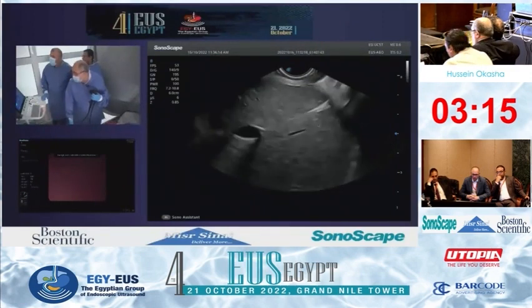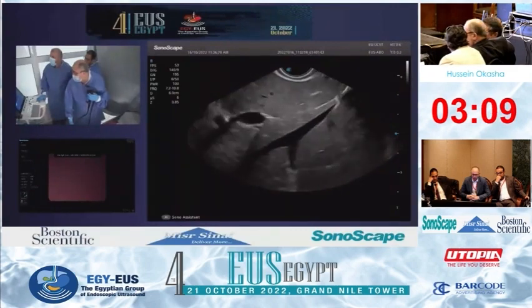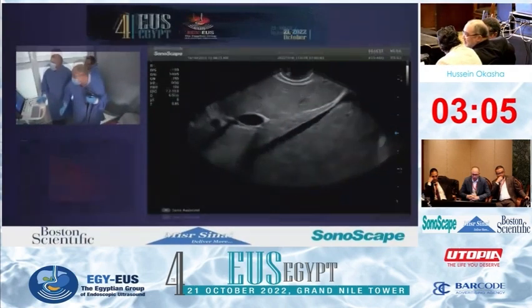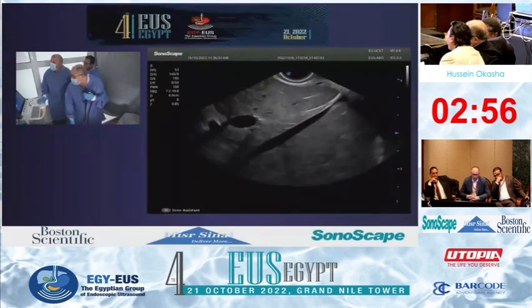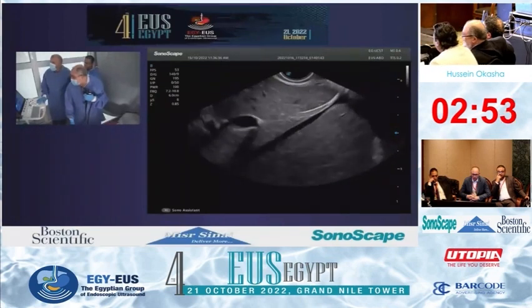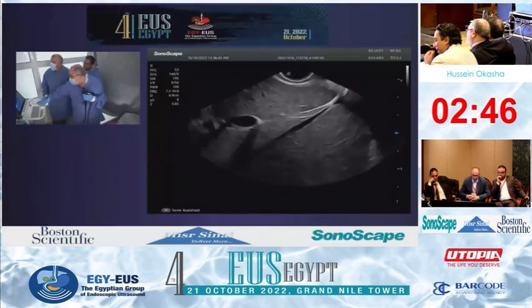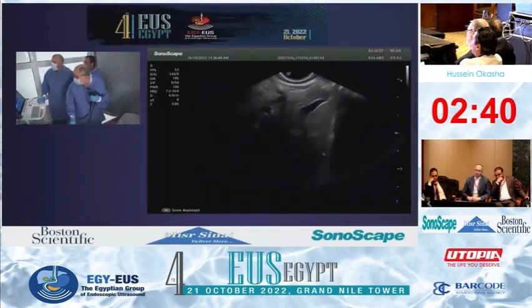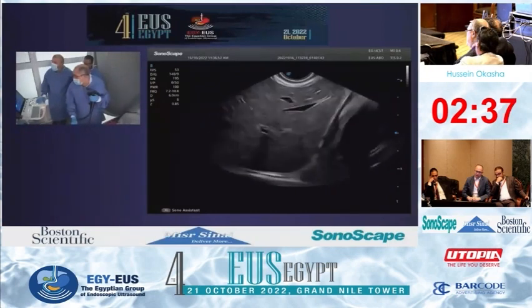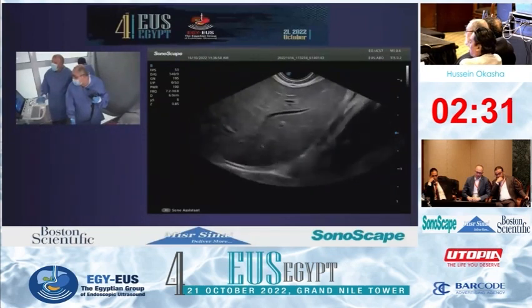And at that level I can see the middle hepatic vein. Here, it divides the liver into three segments. Segment one, again, which is the caudate lobe in between the echoendoscope and ligamentum venosum, and segment 4A in between the ligamentum venosum and middle hepatic vein, and segment 8 given to the middle hepatic vein. So it is 1, 4A, and 8. Keeping anti-clockwise, I can see, yes, very nicely seen the left hepatic vein. Left hepatic vein divides the liver into segment 2 above and segment 3 below.